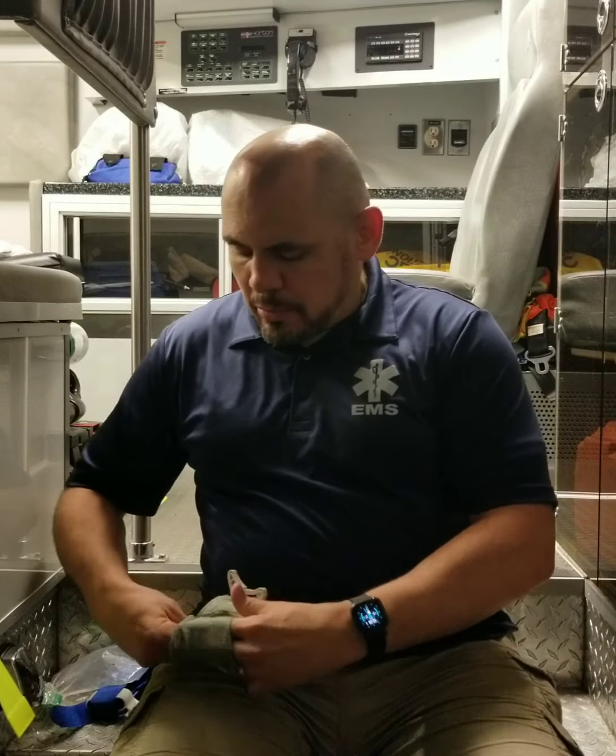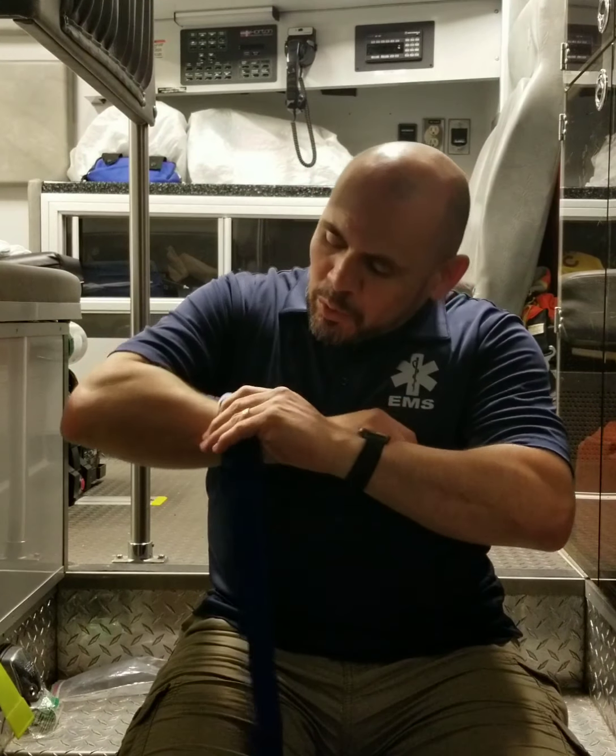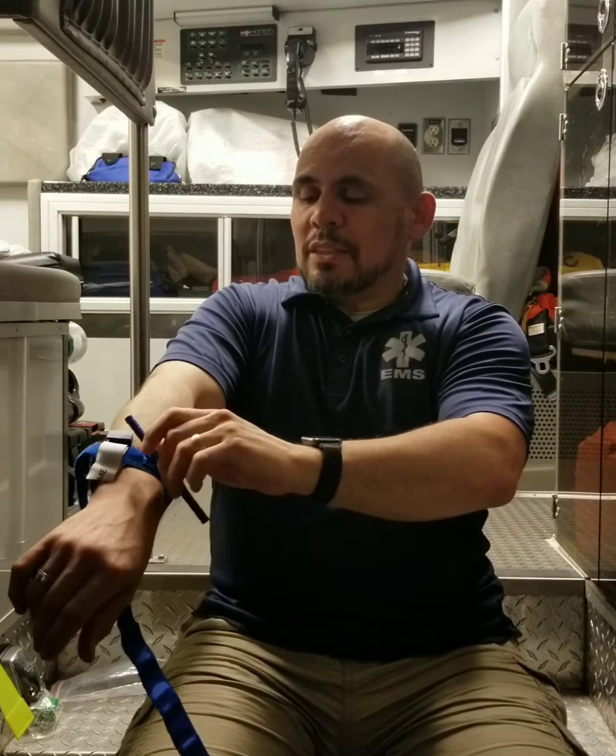So I'm going to use my arm so I don't have to grab my leg. So let's just say the cut is by my wrist, or for the sake of argument, let's just say that I literally chopped my wrist off. So again, I could go up here, like I mentioned earlier, high and tight. If not, I could just keep it a couple of inches from the wound. I want to wrap it, go around it, use the Velcro to tighten it up. I'm going to use the windlass, tighten it. I want to keep tightening it. This is going to hurt. Keep tightening it until the bleeding stops.